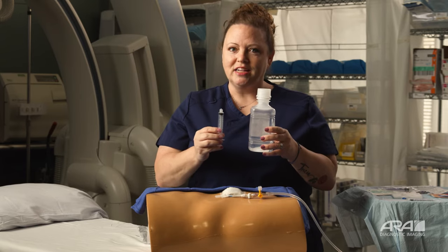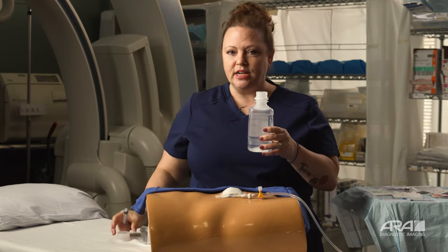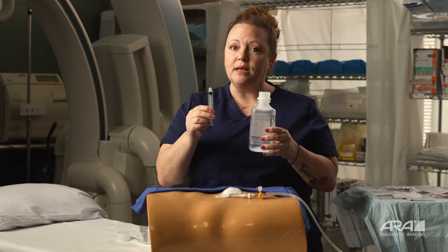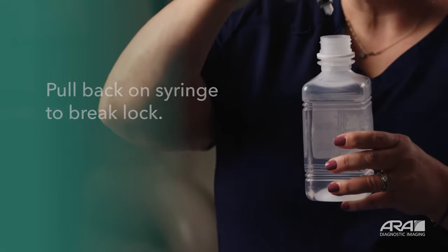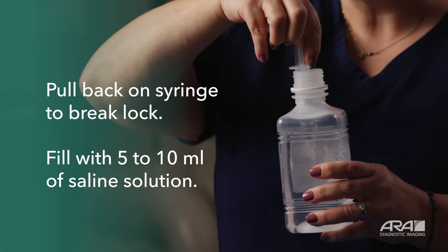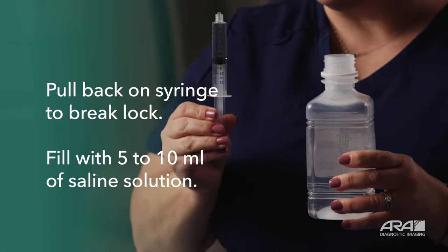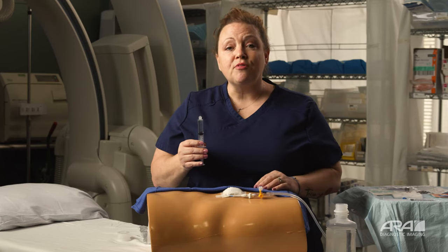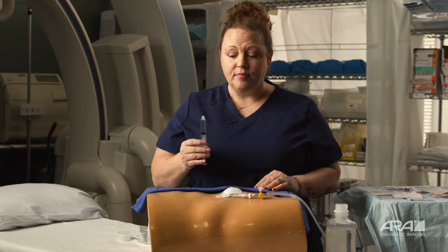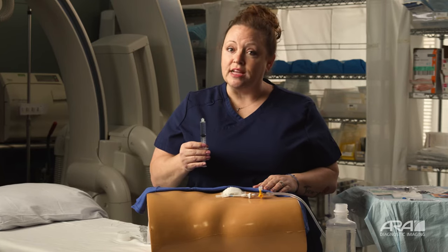Before we get started, let's fill your saline syringe. Remove the top from your saline solution. Break the seal on your luer lock syringe by gently pulling back on the plunger. Insert your syringe into the saline solution and draw back 5 to 10 milliliters of fluid. You'll notice on mine I have 7 milliliters of fluid. Make yourself comfortable — you can do this from a seated or standing position, or you can lie back. I have this drape for demonstration purposes only; you do not need a towel or a sterile area to flush your drain.